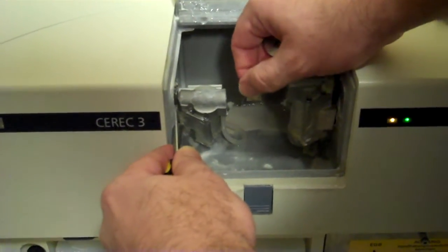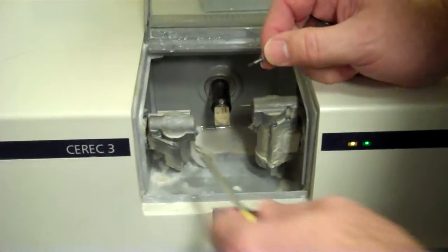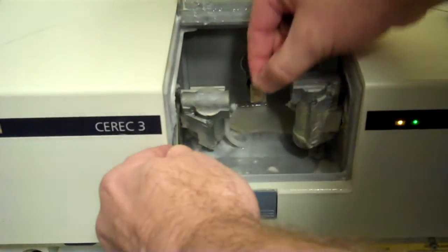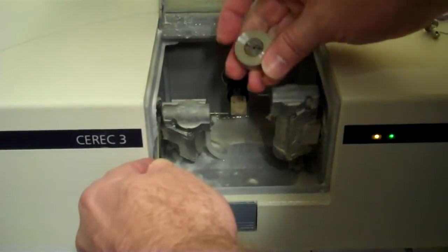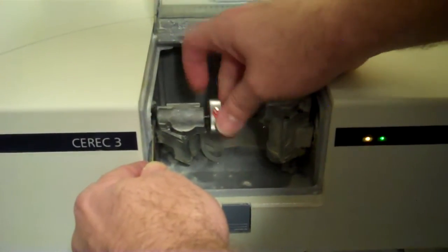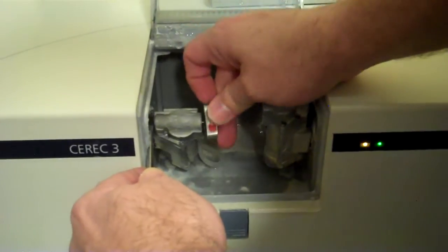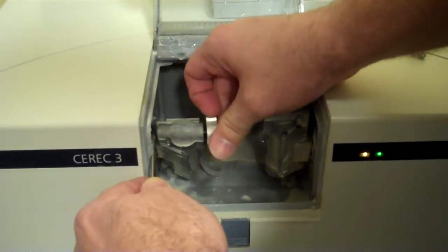So to put it back in, you would do exactly the opposite. You push the button in, get the burr in there, get your burr tool on there, spin it. You're going to feel it getting tighter.